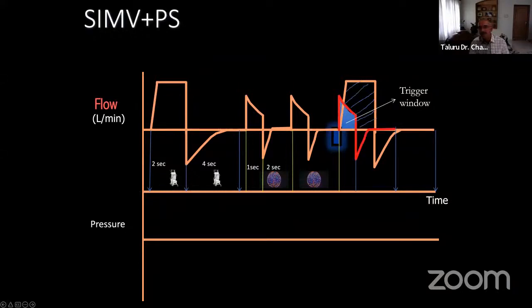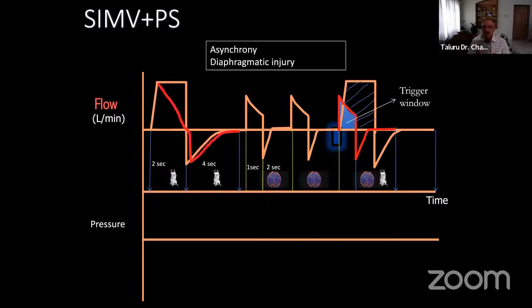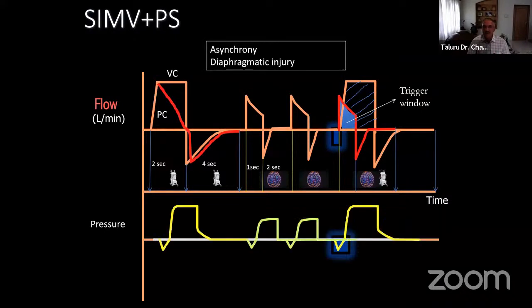See, it was breathing like this. If I shift this here, it was breathing like this. Now it has to breathe like this. Why will the diaphragm keep quiet there? Because you always don't consider the neural or the brain component. See here, the pressure has gone up much more than this. It sometimes may go up.